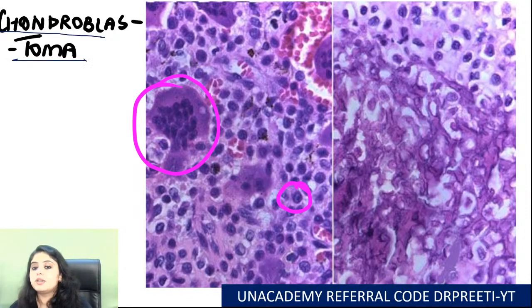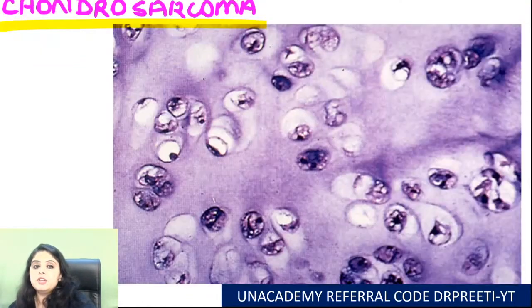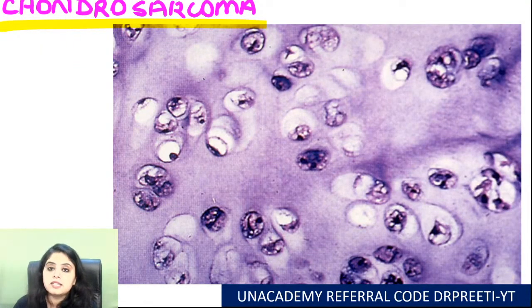Chondroblastoma. Chondroblastoma has 3 things. Giant cell, number 1. Mononuclear cells with grooves, and number 3, chicken wire calcification. Are we sorted? Right? Okay, great. I see a couple of you answered oligodendroglioma, which is amazing. Moving on, coming to the malignant tumor of cartilage. So which were the other ones that we did?